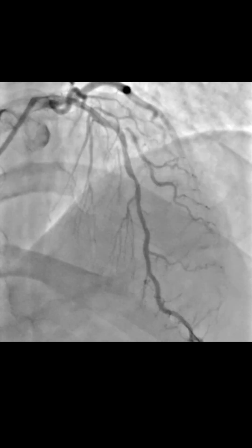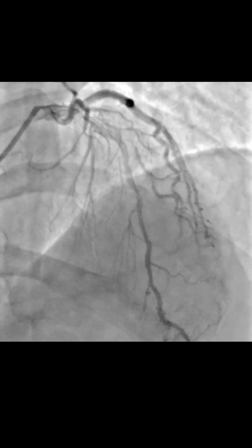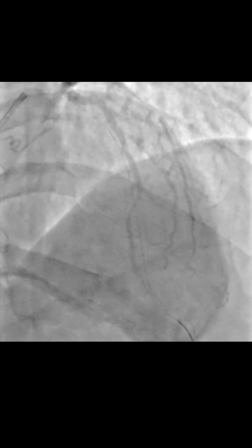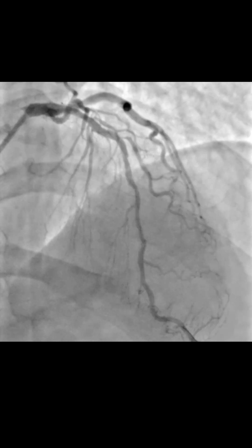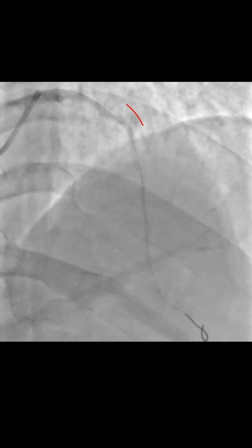And this is exactly what happened here. After we used our scoring balloon, we had a significant gain in the lumen and the dissection was turned from a vessel-threatening dissection into a much more friendly dissection. We then waited several minutes to make sure there was no significant recoil.